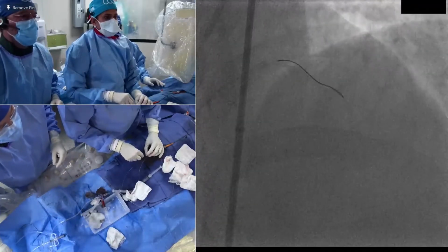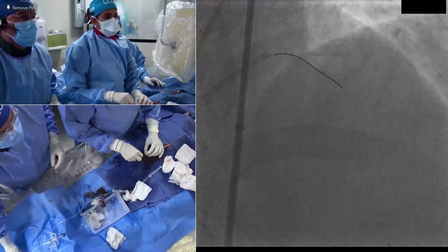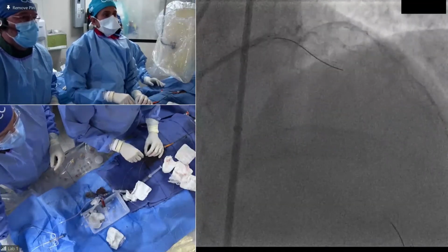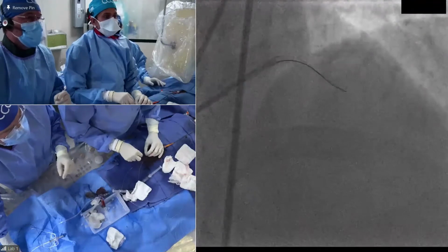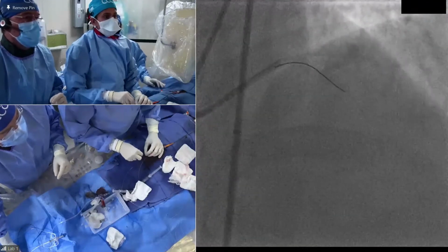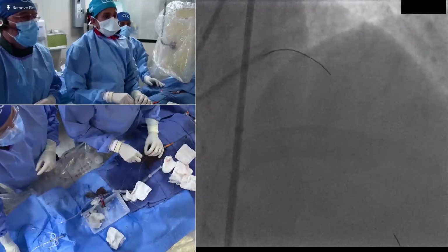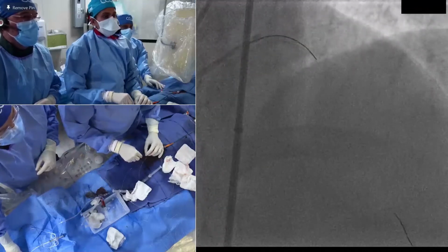You see a little dye? Some dye, or we have to go with the Fielder Fine Cross, right? I think this is the case. Yeah, get me the Fine Cross. Leave it in the diag. Leave it in the diag. It's actually going to the D2. This, I think we may dissect. Let's exchange with the Fine Cross. Okay. Get the Fine Cross?